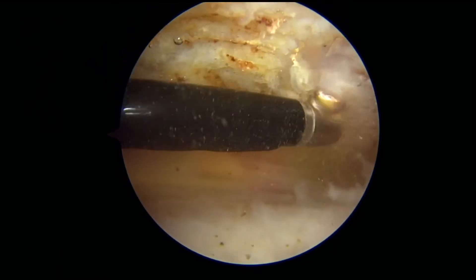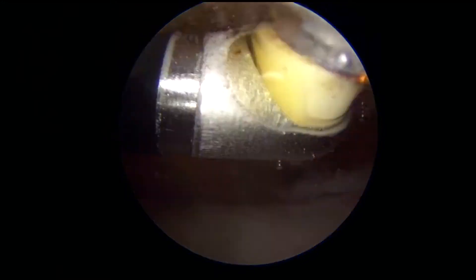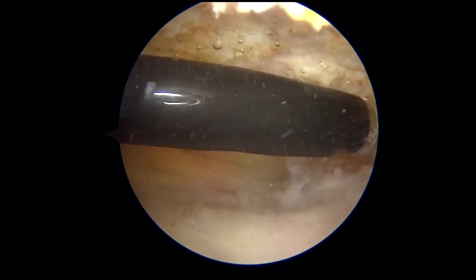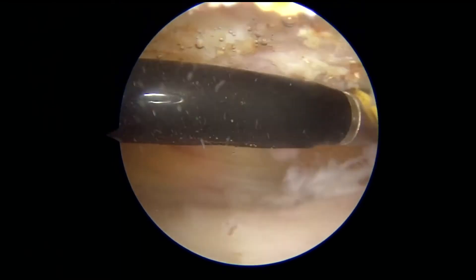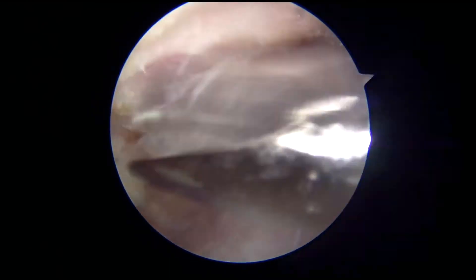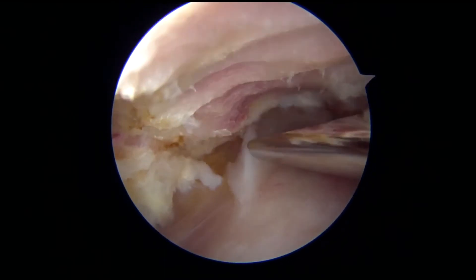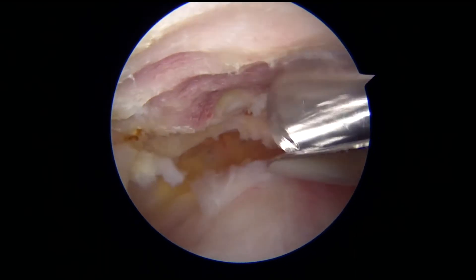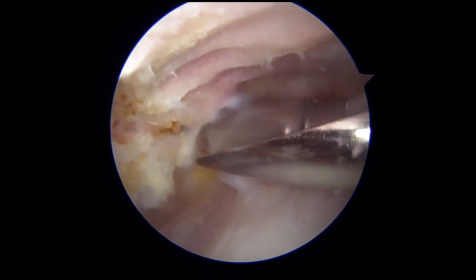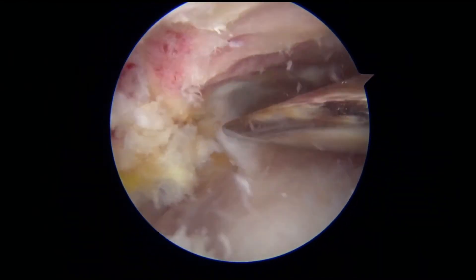So the first thing that we do is we actually expose the bone by removing the tissues across it, and then we use a device called a burr that allows us to smooth out the bone and remove the bony prominence, which you essentially see here. This device is a burr — it's basically a high spinning device that smooths out the bone and removes it to make it smoother. This portion of the procedure is not necessary in every patient, but it's frequently performed in conjunction with the rotator cuff repair.